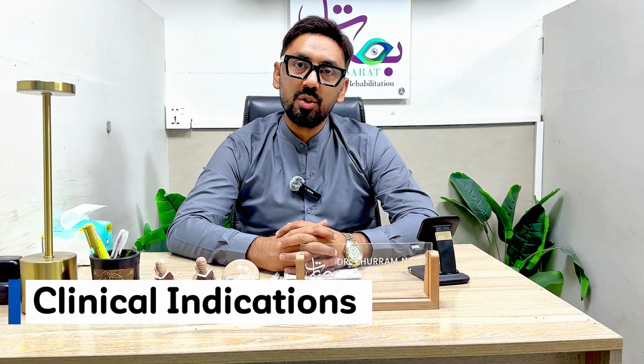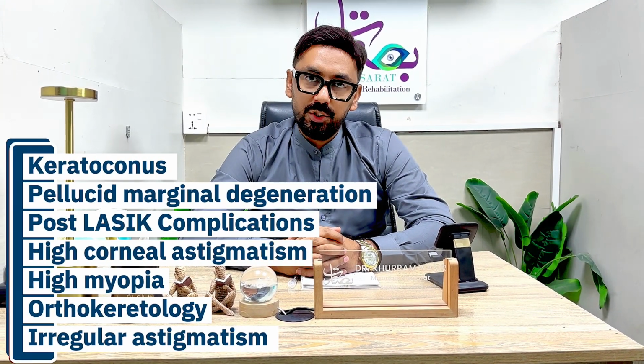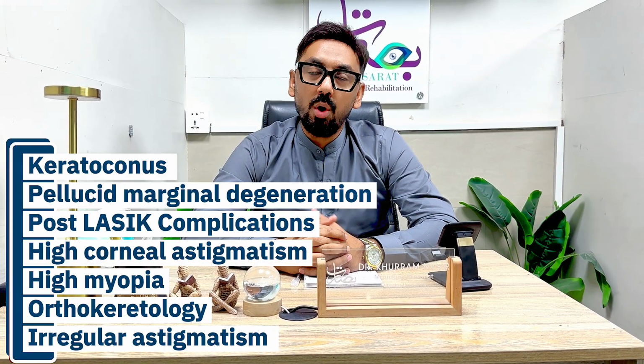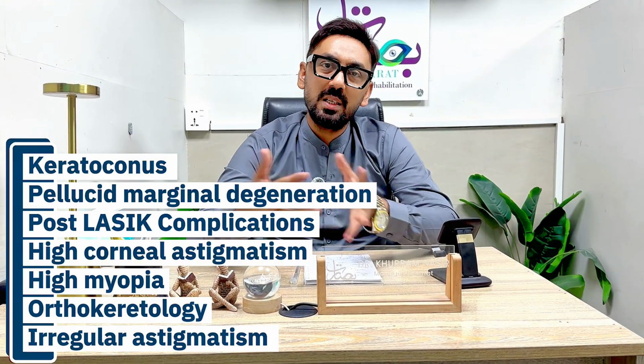Now we will discuss the clinical indications of the RGP lenses, to whom we have to prescribe the rigid gas permeable lenses. We can prescribe RGP lenses in keratoconus, pellucid marginal degeneration, post-LASIK surgery complications, high corneal astigmatism, high myopia, and in orthokeratology. So in these specific conditions, we can prescribe the RGP lenses.